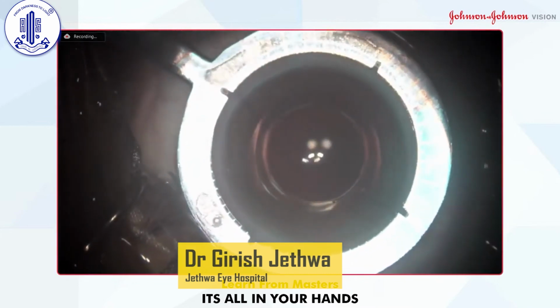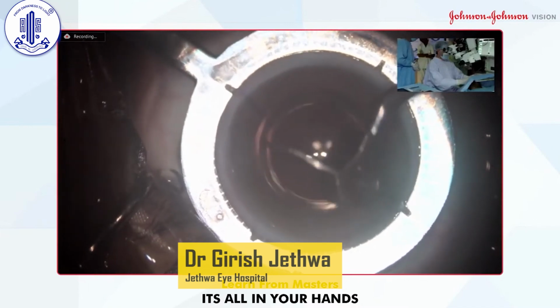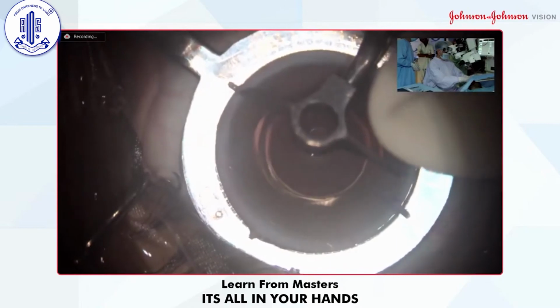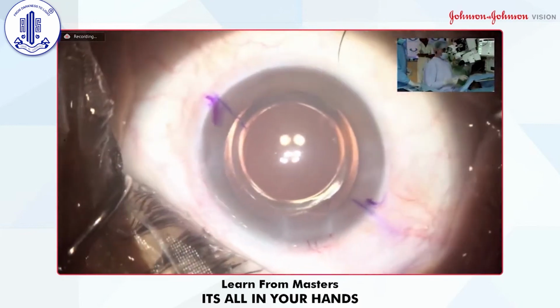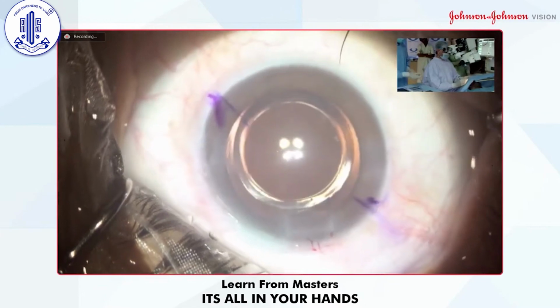So this is 1, this is 178 means 2 only. So not much marking required because the original marking is more or less same as what we want.